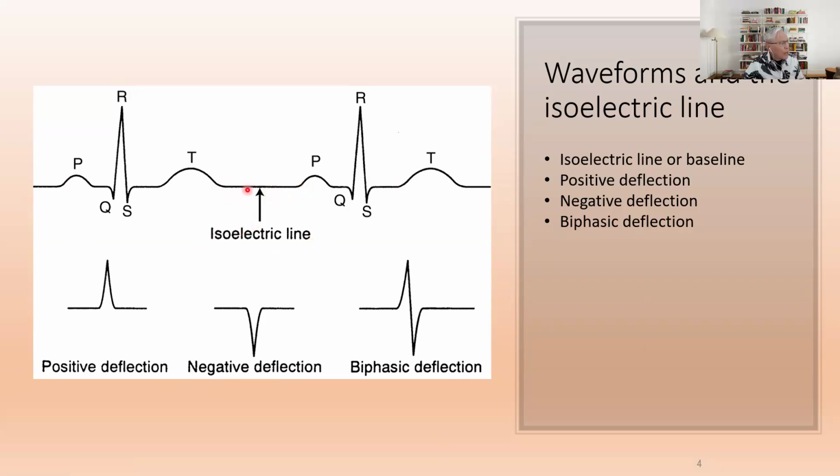So this is where nothing occurs, or it's presumed that if there is electrical current happening, it is going to be a representation of a slow movement of electrical current. Okay, so a flat line in an electrocardiogram means two things. One, it's either going to be no electrical movement at all, or two, there's going to be electrical movement, but it's so slow that it becomes very negligible.